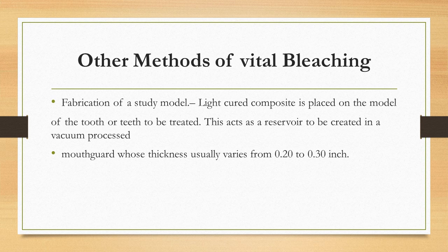Definitely, if you are using the halogen and the xenon lamp as a heat source, you need 15 to 20 minutes. But if you use the laser, 30 seconds is long enough to bleach. It's the upper limit for the time used to bleach the tooth when you are using the laser.